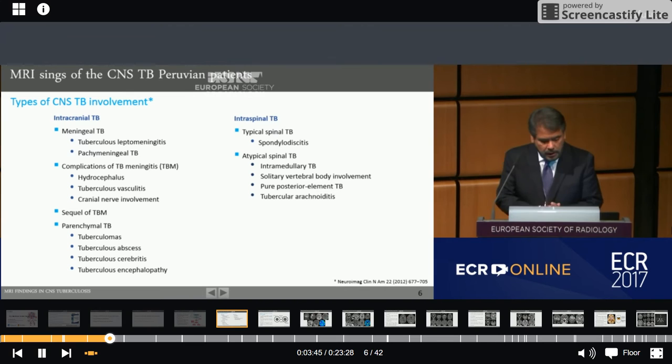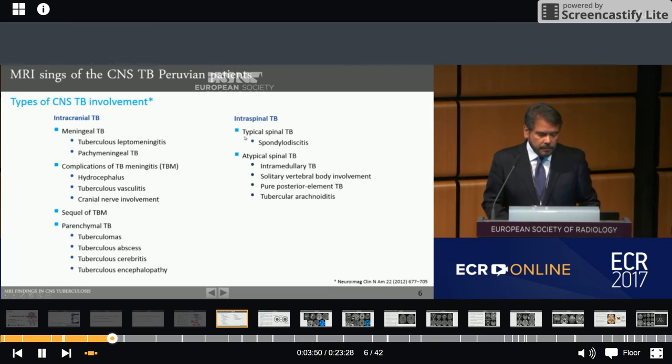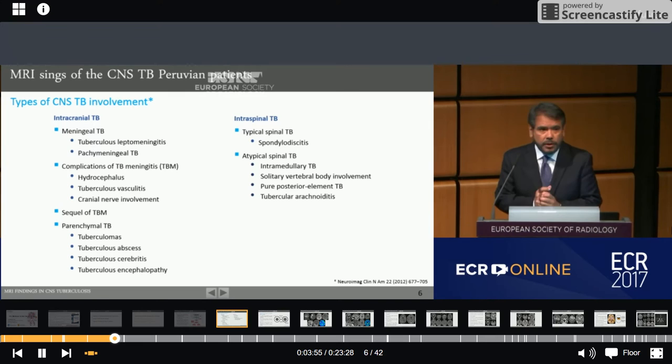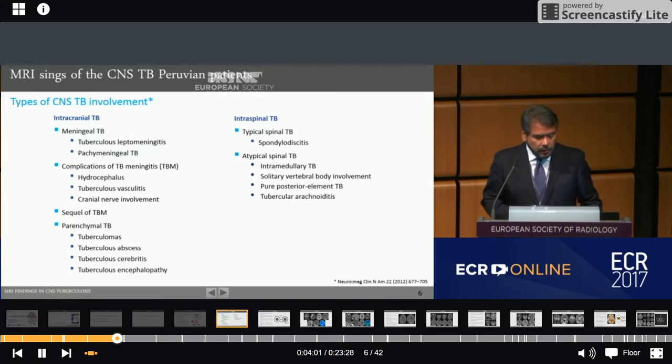Within intraspinal TB, there is typical spinal TB like spondylodiscitis, which will be discussed by Dr. Jeremy Carpio in a later presentation, and atypical spinal TB including intramedullary TB, solitary vertebral body involvement, pure posterior element TB, and tubercular arachnoiditis.